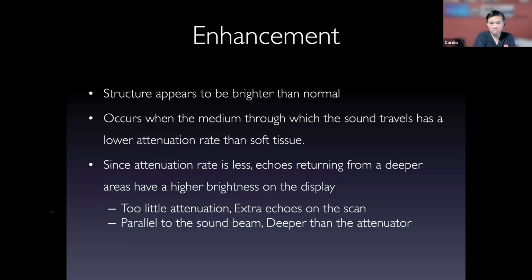This particular presentation is very useful for preparing for echo exams, for example the National Board of Echocardiography exam, as well as for sonographers preparing for your sonography exam, because this is part of the extended physics that we will talk about, because of the art of interpretation. The art of interpreting echo is the art of interpreting artifact. This is actually from Dr. Levine. I quoted.